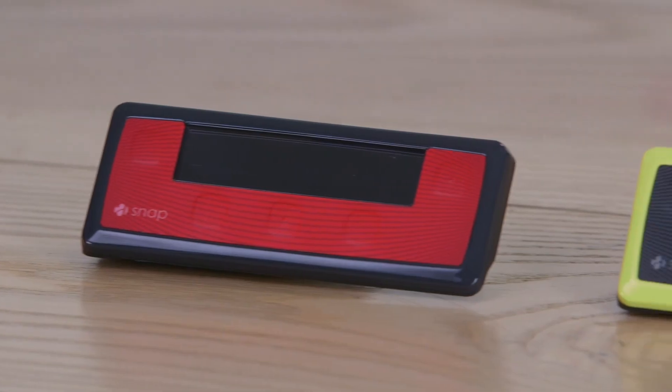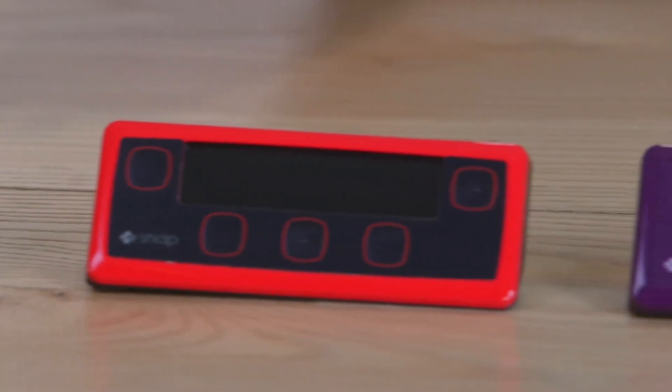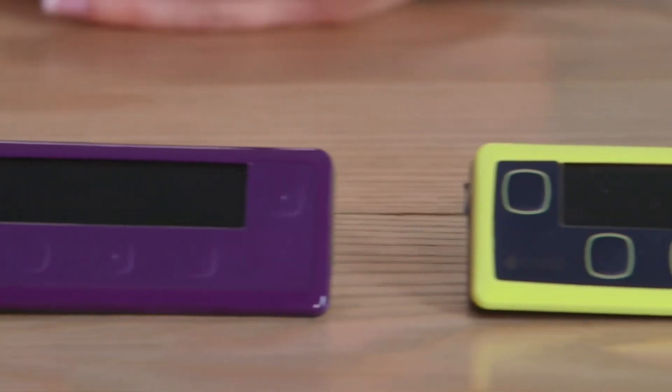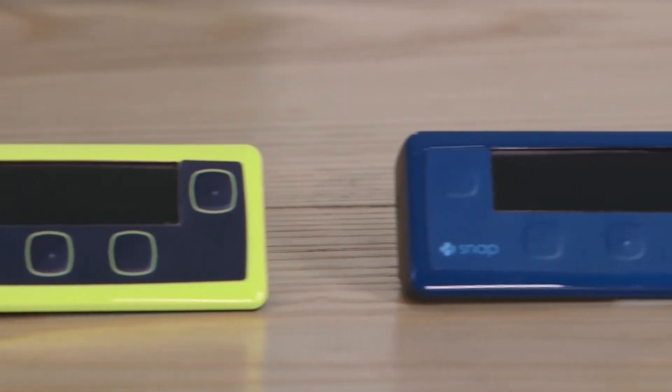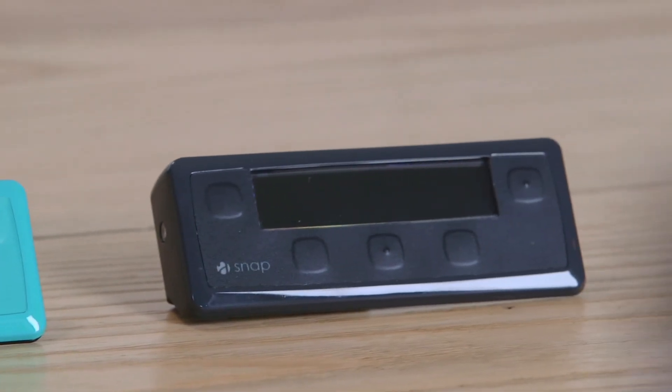Each pump is made to order right here in Silicon Valley. Here are just a few samples of what your customized pump could look like, and there are literally hundreds of combinations that you can make your very own. Design your pump today at snappump.com.